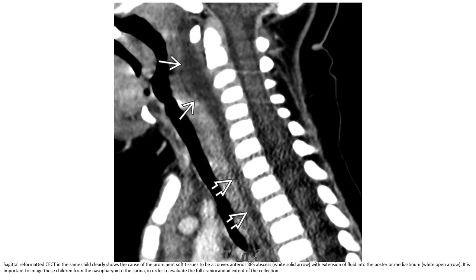Let's see the same case on CT. Clearly there is bulging soft tissue with a convex anterior retropharyngeal space collection. It is important to image from the nasopharynx to the carina in order to evaluate the full craniocaudal extent of the collection.